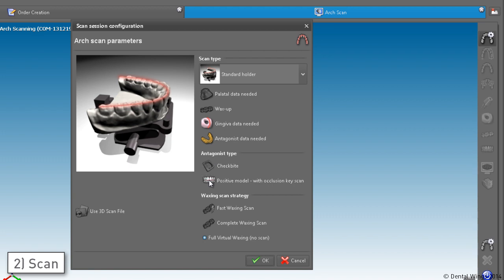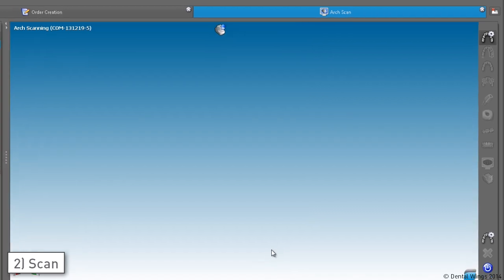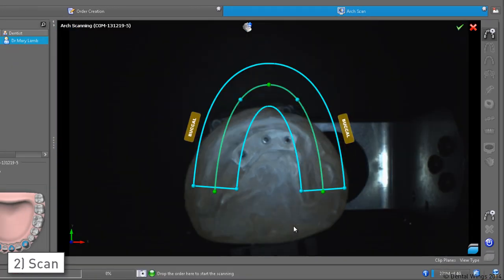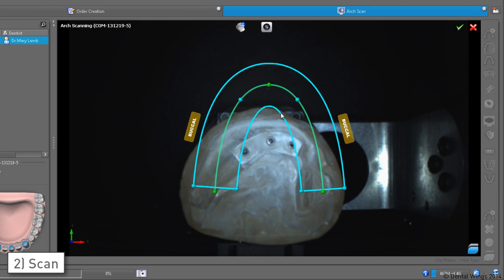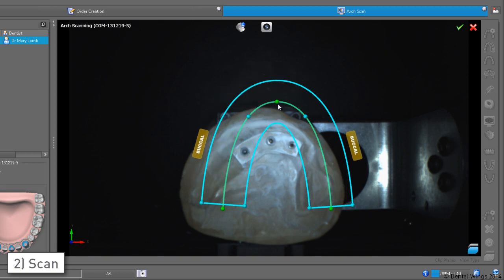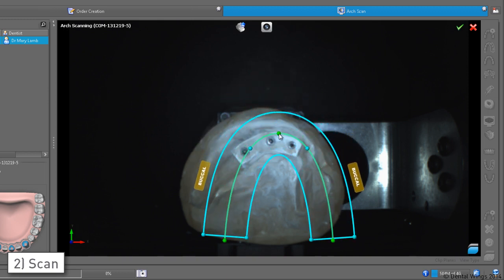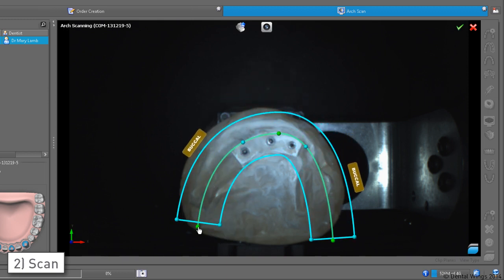If you have an antagonist, this is where you're going to request its scan. As usual, we place the model in the scanner and within the preview we position the arch and define the area of interest.